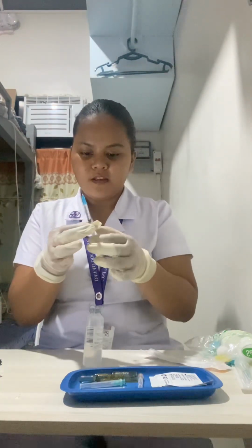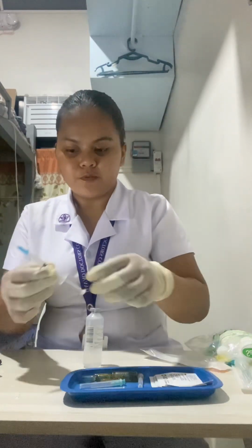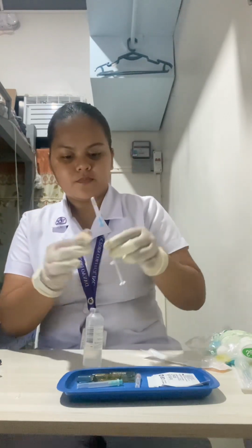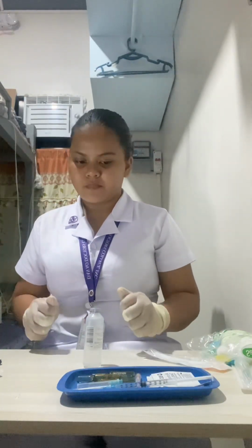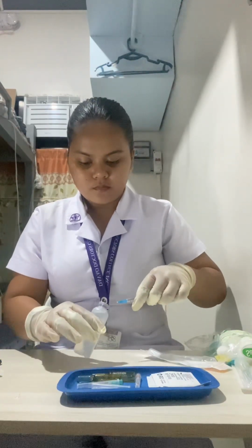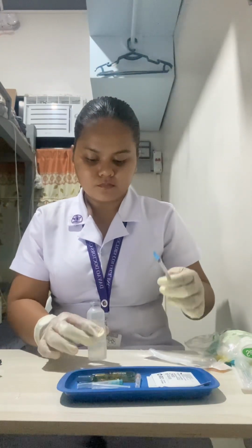Okay. So now I have here 0.5 ml of medication that is prescribed by the doctor. So I'm going to cover the needle using a scoop method. This is to prevent any needle stick injury.